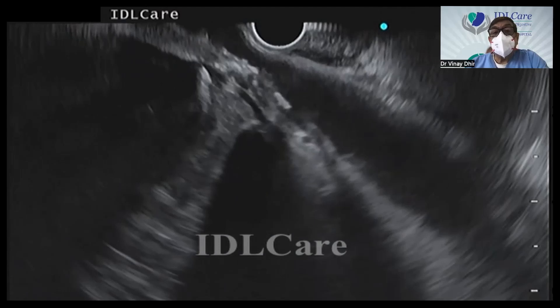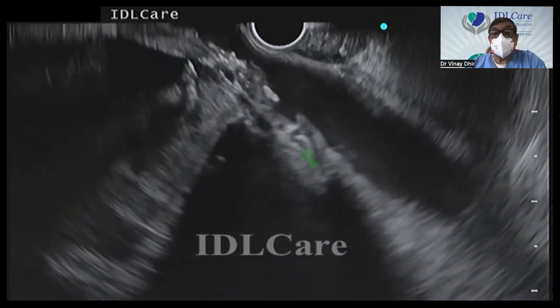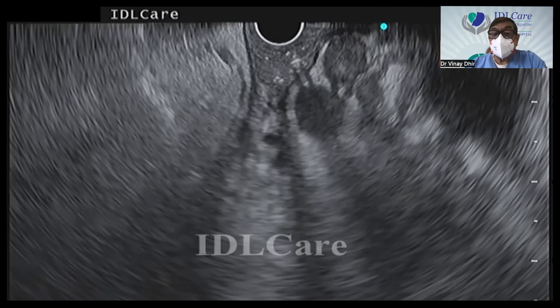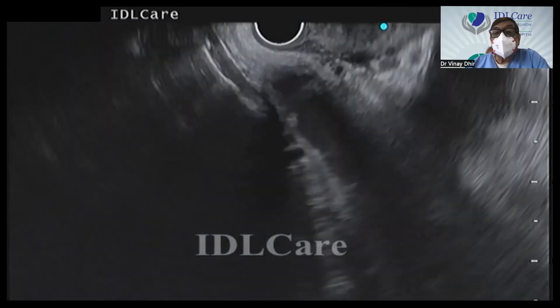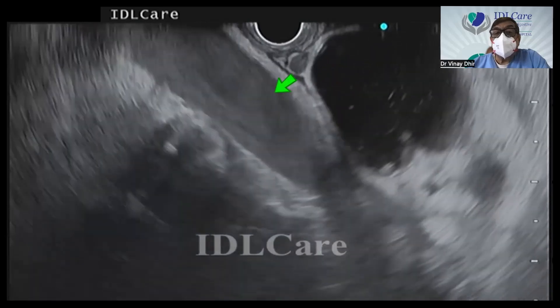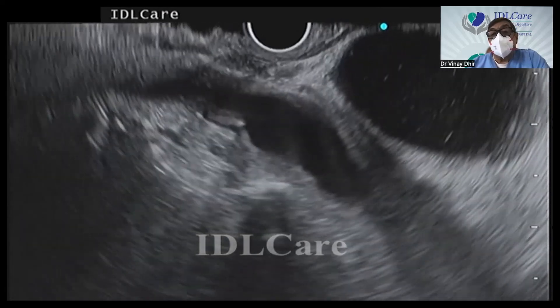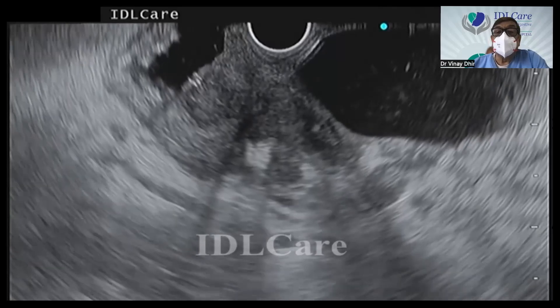What is the movement that we do here? Once we go to the second part of the duodenum, we shorten the scope like we do for ERCP. First movement should be anti-clockwise — like this. When you do anti-clockwise you will have a view like this. You will see the spine, and you will see the aorta and the IVC. These are the lymph nodes. Then when I shorten and turn anti-clockwise, you see the duodenum here — this is the IVC. Then turn clockwise, you will see the aorta. Once you see the aorta, tip up clockwise and slow withdrawal millimeter by millimeter, and you are at the ampullary region.